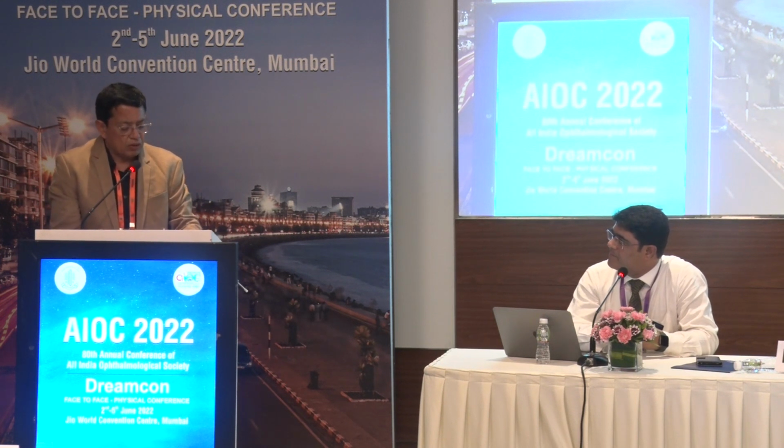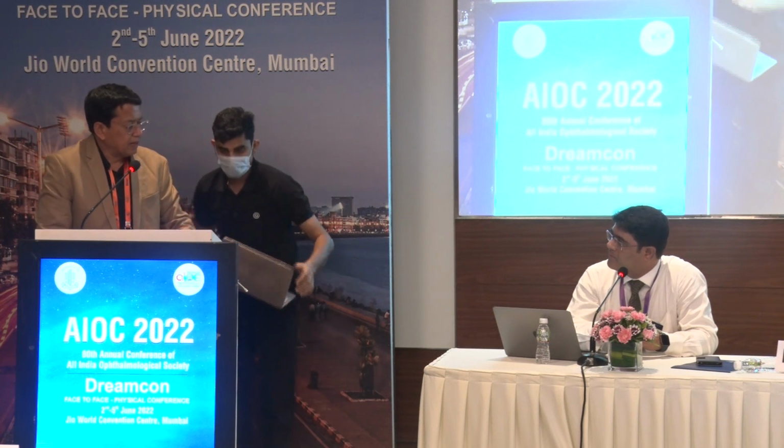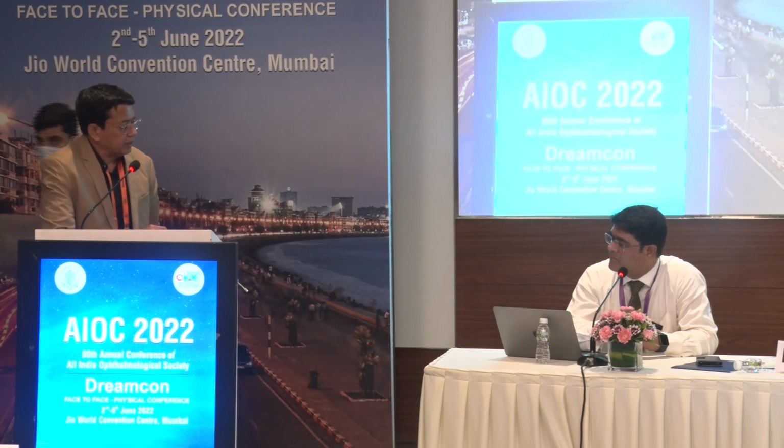Sir, do you believe that the total keratometry which is being used in IOL Master 700 has better results than Barrett Toric calculator? Yeah, in the sense that, as far as toric intraocular lenses are concerned, Barrett himself has shown that with the Barrett TK formula, Barrett 2K TK and Barrett TK toric formula, the results are slightly better. But in case you are doing it in a post-refractive surgery scenario where the relationship between the anterior cornea and posterior cornea is disturbed, in that case actually measuring using a TK would be a good idea.